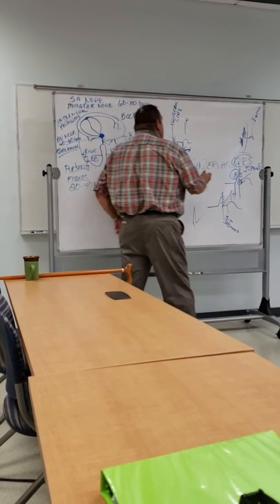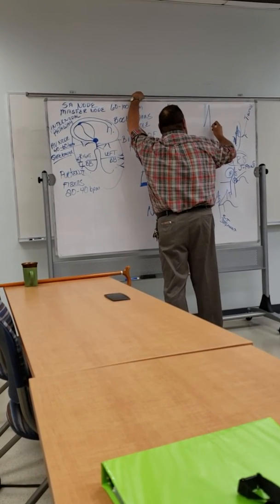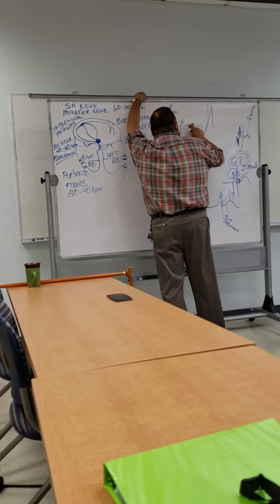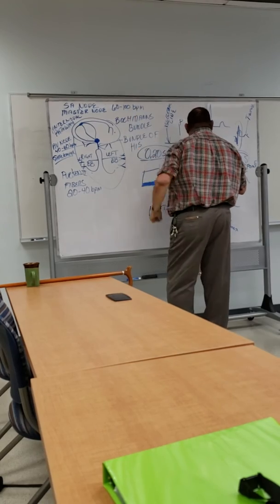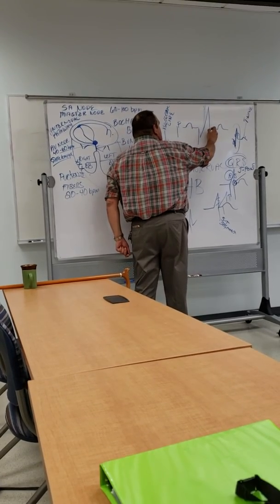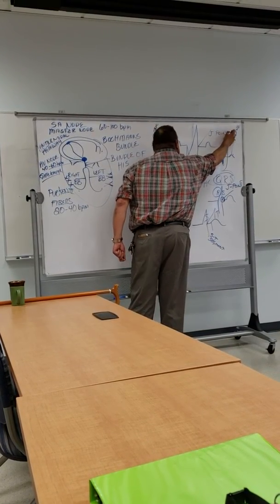what I was telling you about your QRS, okay? Just say this is the QRS right here, and you're leaving off the isoelectric line. This is your P wave. I'm making it a little bit larger so you can see. But from the beginning of your QRS to the end where it goes to the isoelectric line, and this is your J point, you have to remember that.